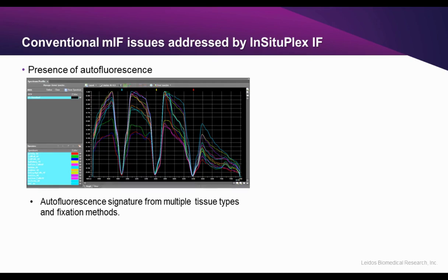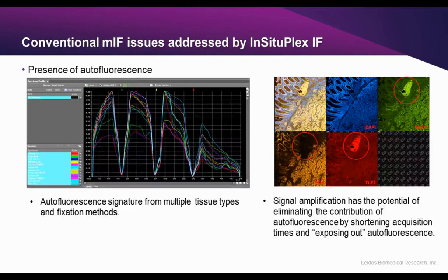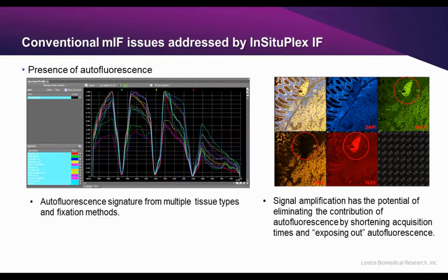This is a plot of autofluorescence from multiple tissues, with multiple fixatives and storage ages from source blocks. While the trend is the same — starting high in the 400 nanometer range and diminishing towards 800 nanometers — the amplitude varies greatly. A well-thought-out amplification strategy can mitigate some of this by exposing out the autofluorescence. Here, the beta-catenin in orange is amplified and the other fluorophores were detected without amplification. Since the capture was quick enough in the beta-catenin channel, the underlying red blood cells' autofluorescence was not captured and would not pose an issue during analysis.